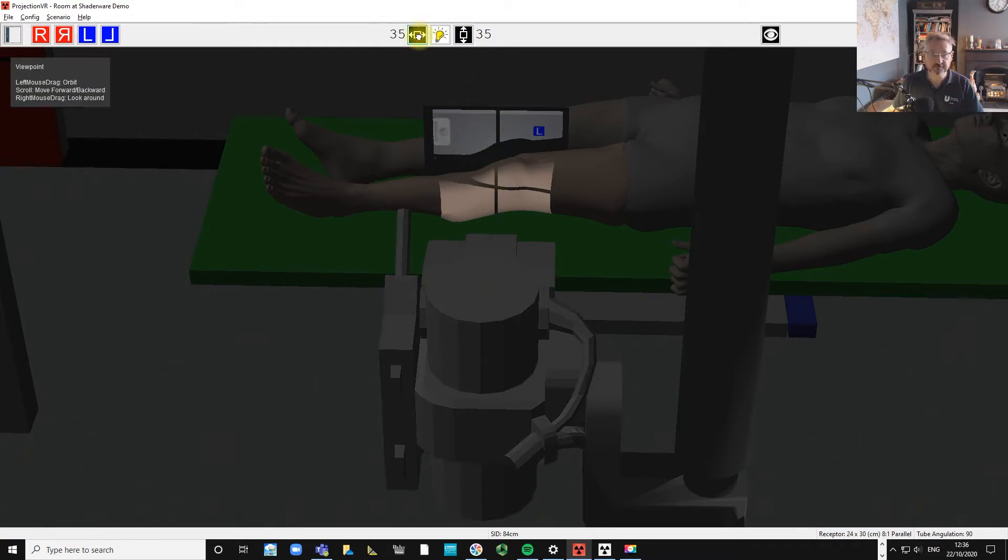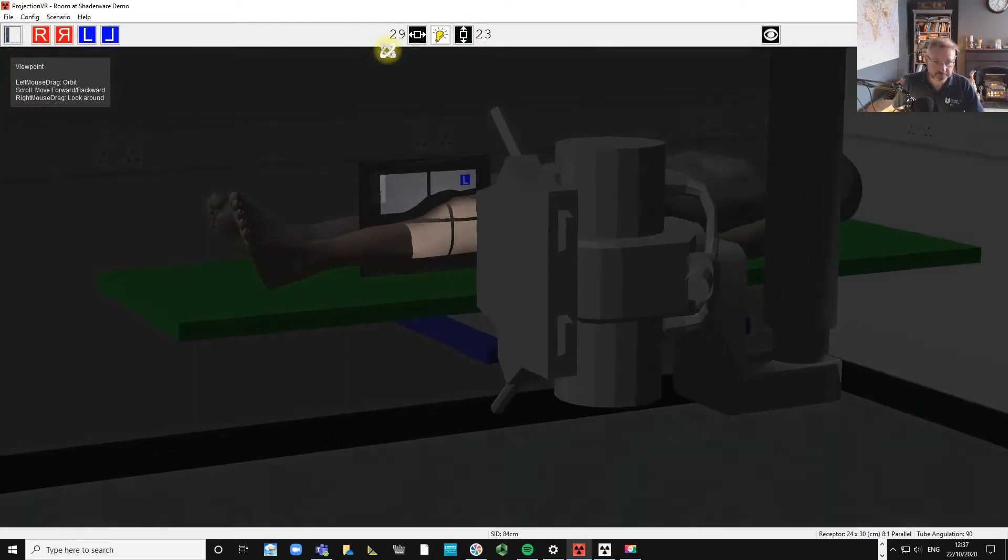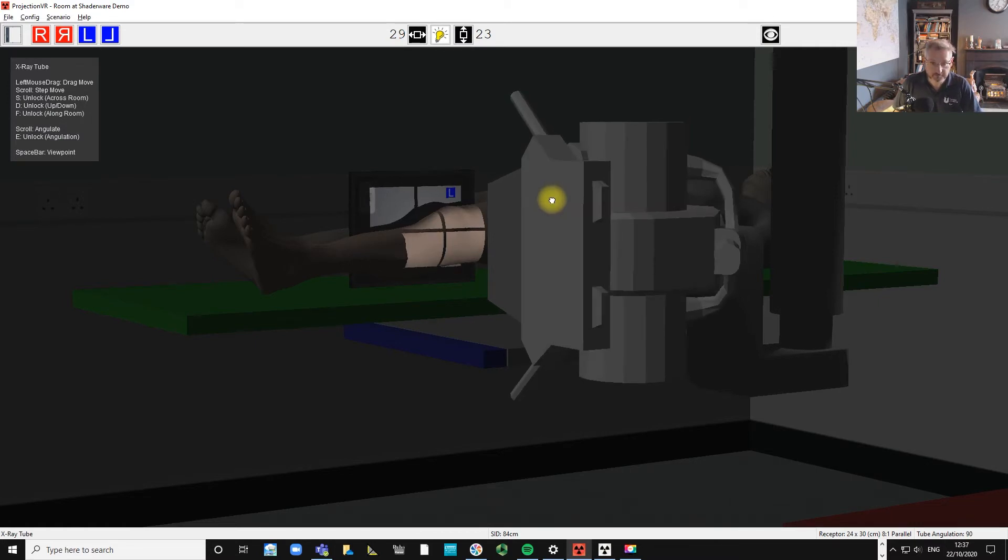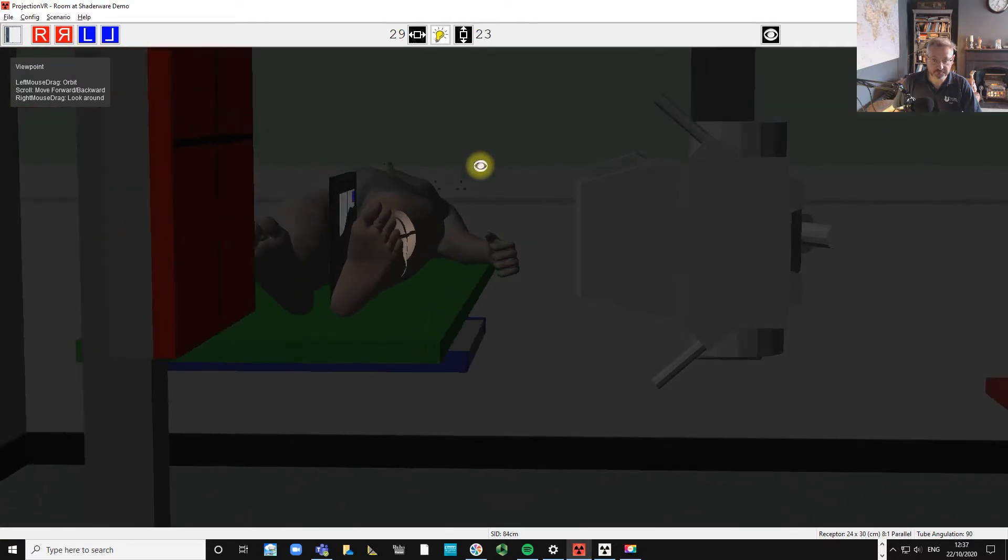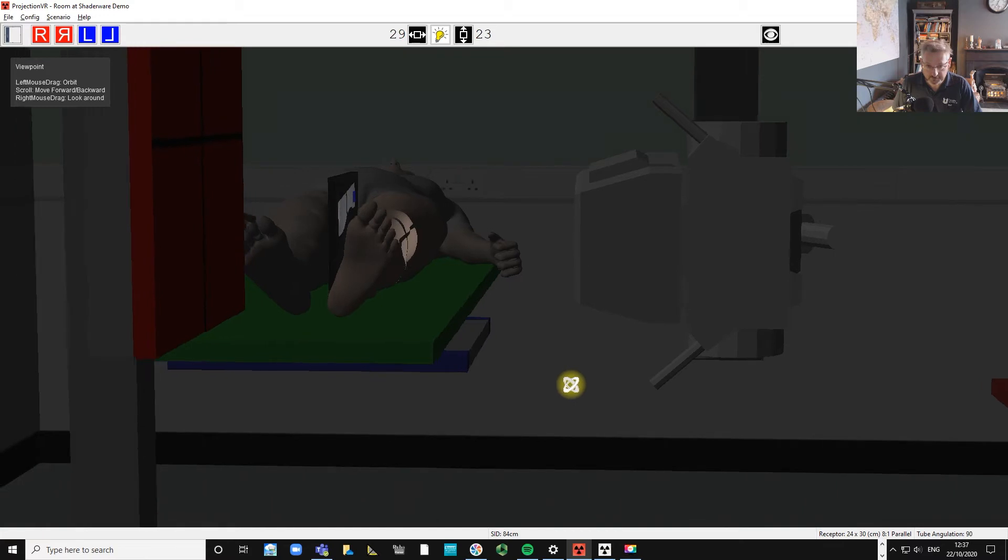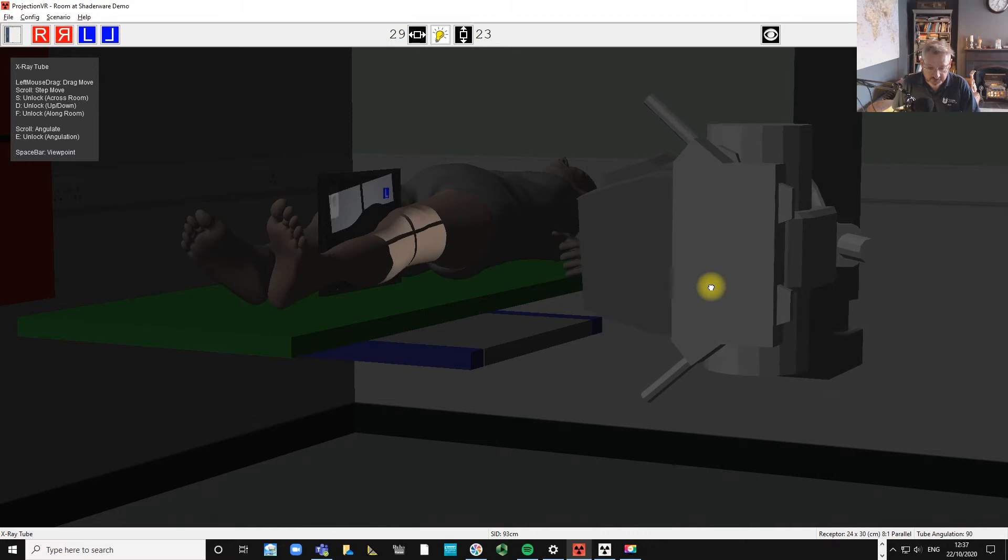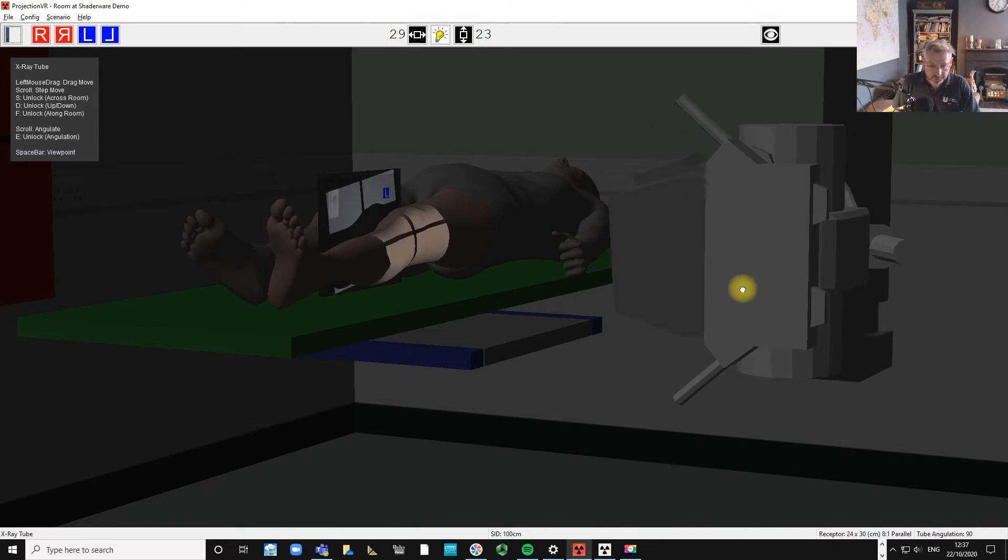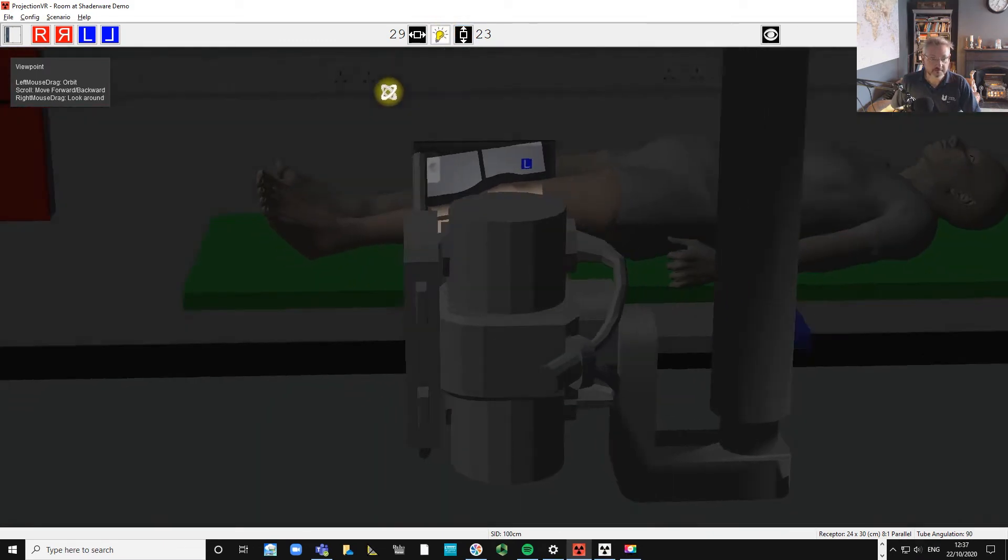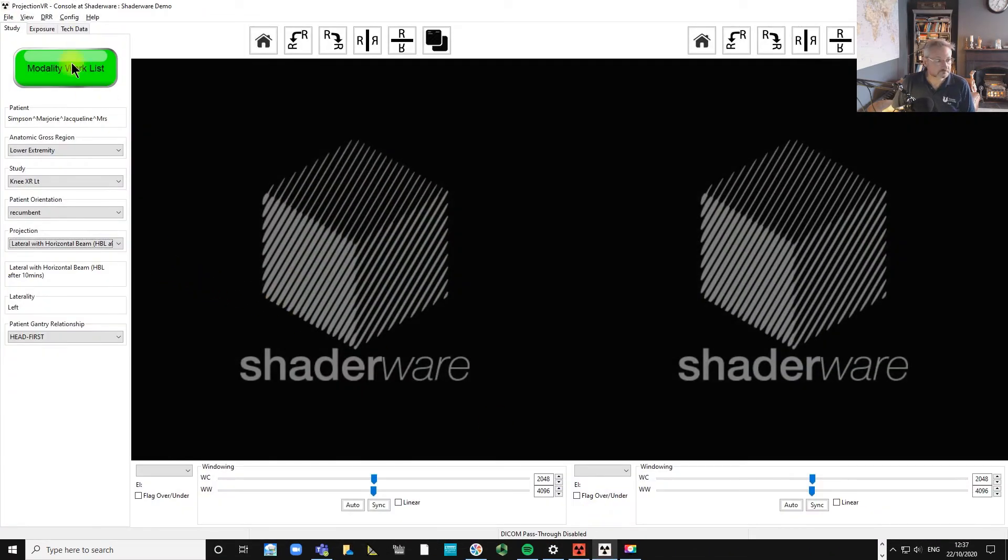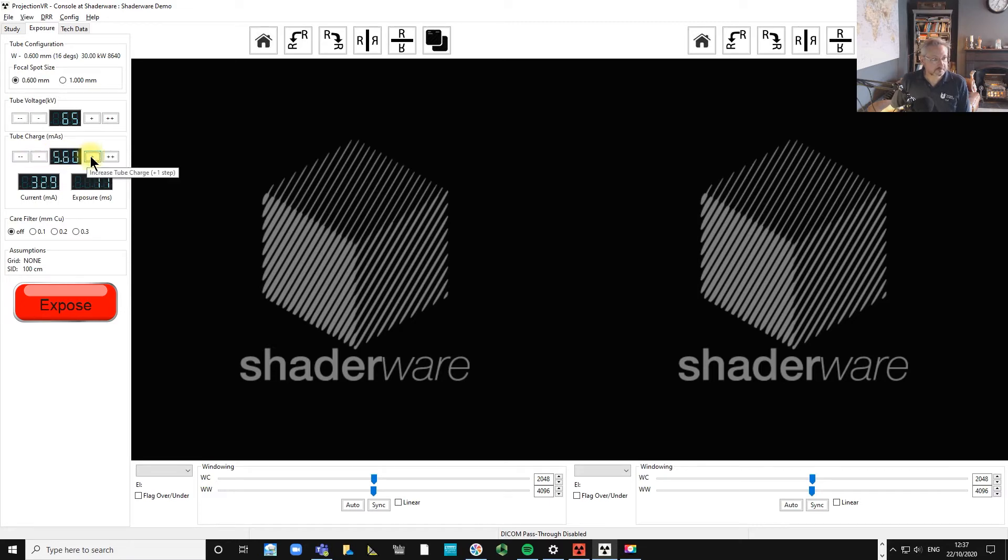Something like that. We can go a little bit further down, maybe turn our light beam diaphragm a little bit and bring the tube out because we're at 84 centimeters at the moment, so we'll take it out to 100. So something like 65 and 5.6 might work for us.